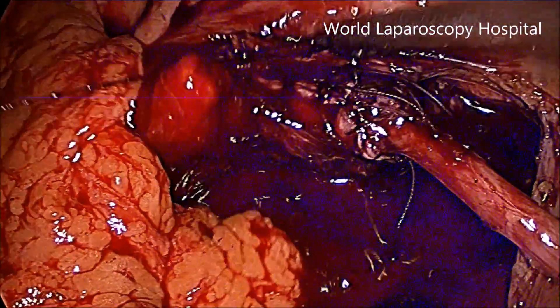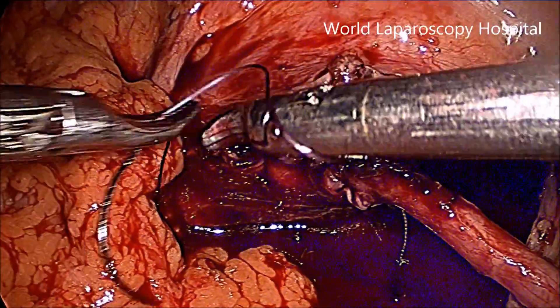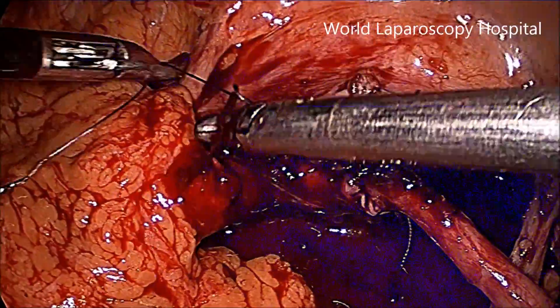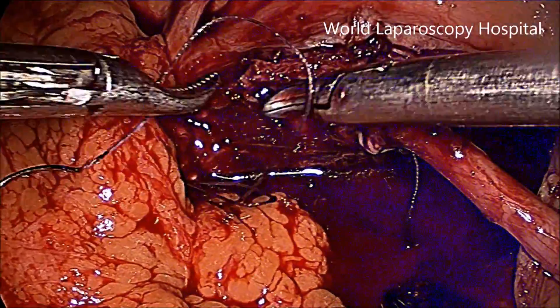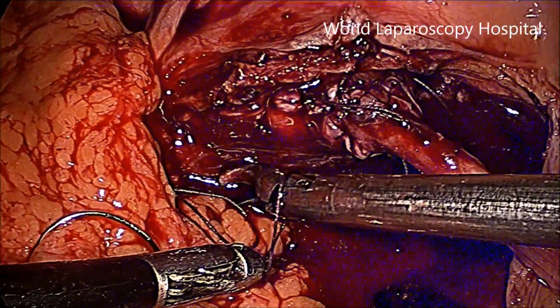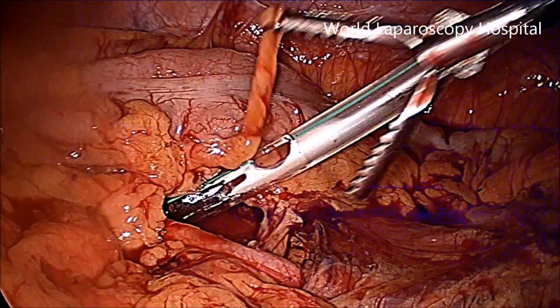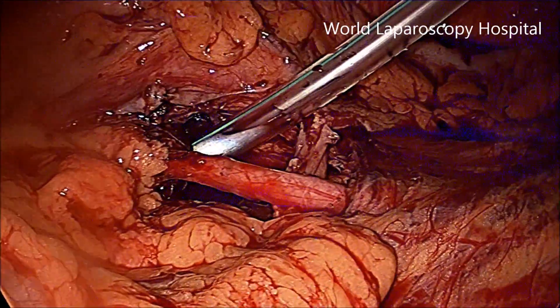Now this is the final termination. The suture is cut — this is just the final knot — and then you can cut the suture. Here the drain is introduced. Thank you very much for watching this video of pyeloplasty.